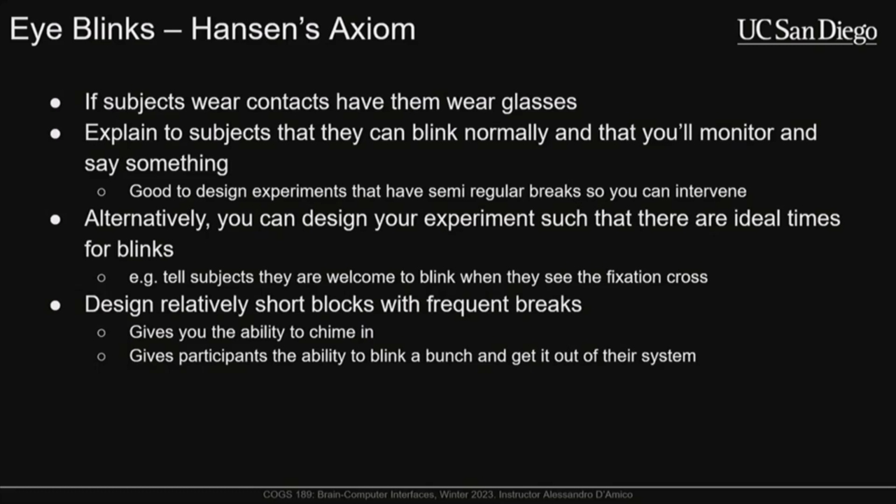Let's say that those blocks are about 1 to 2 minutes long. At the end of that 1 or 2 minute block, you say, okay, you're going to have this break period every 1 or 2 minutes. During this, feel free to move around a little bit.